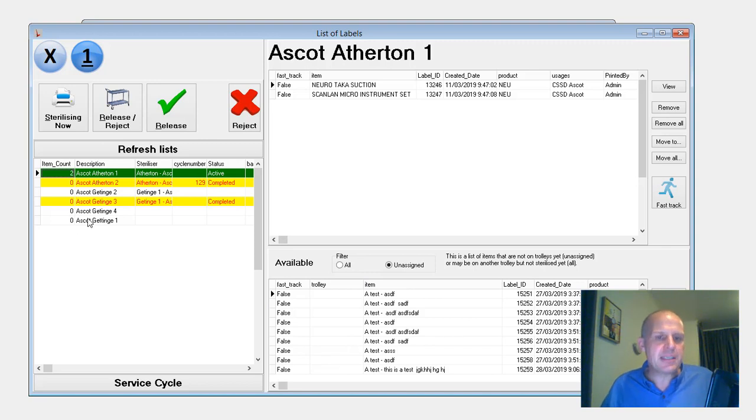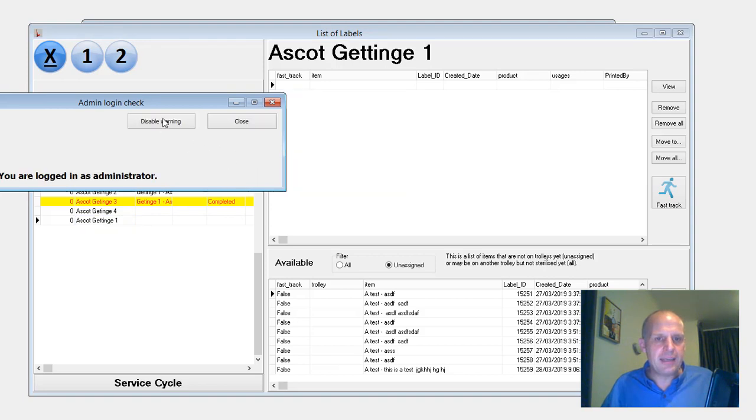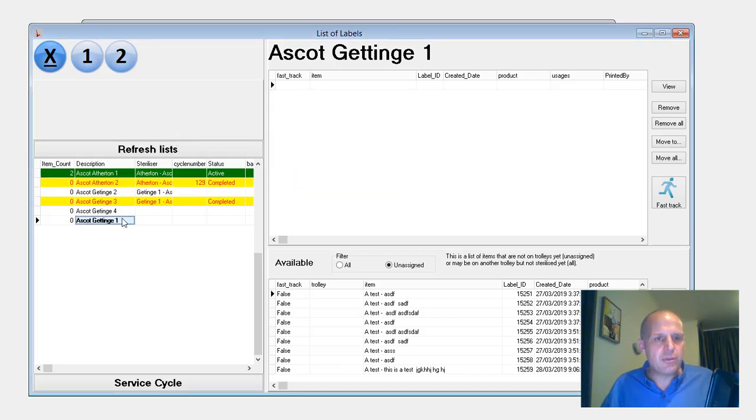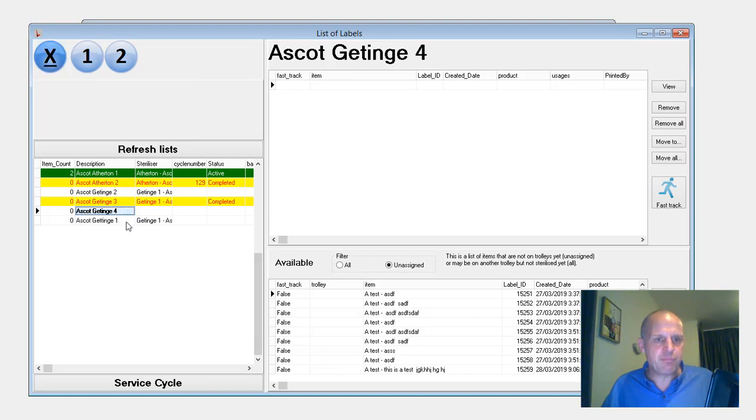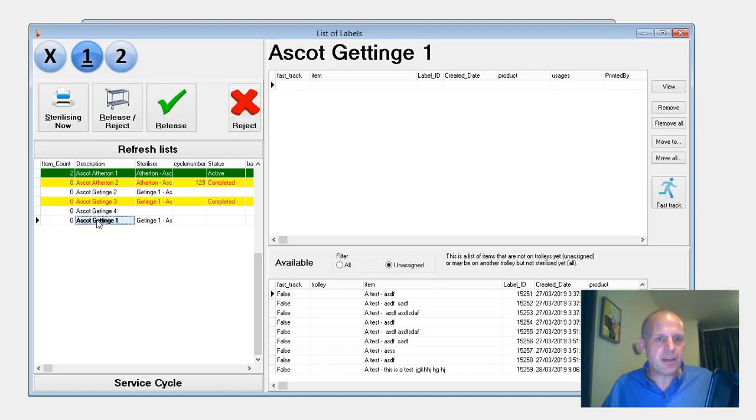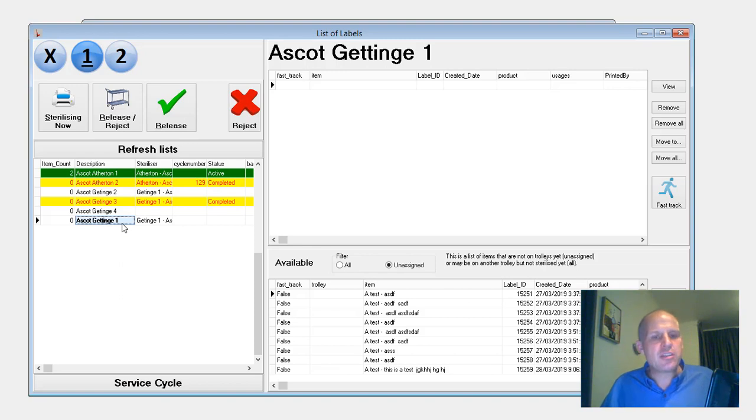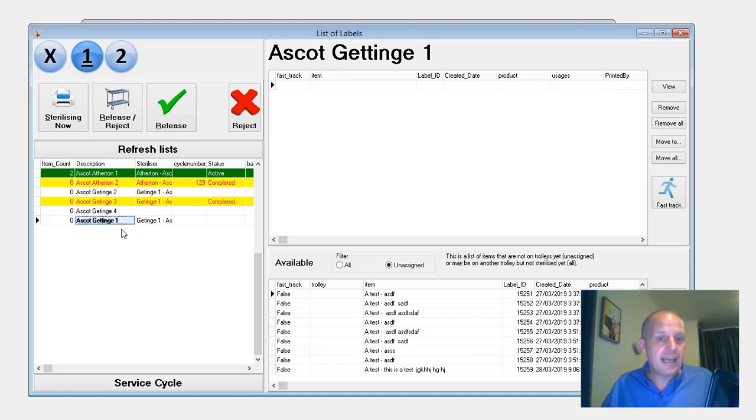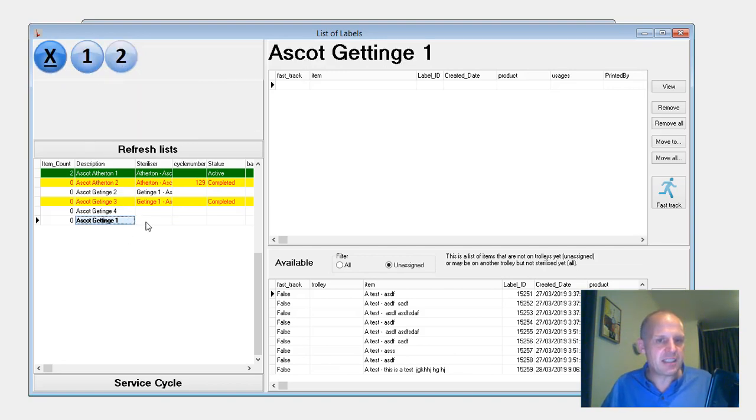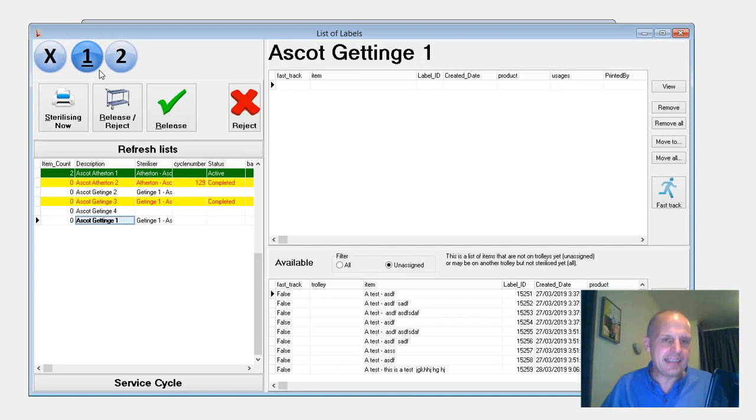But now what happens is, if I'm loading this trolley into Sterilizer 1, for example, I've pushed the one and now it's now locked into saying it's now been placed in that steriliser. And I can press sterilising now and I won't be able to scan any more items onto that trolley. So that's just making it easier for it to be hopefully more obvious to what's going on. But for whatever reason, if we decide not to turn that steriliser on and we want to remove that trolley again, we just press the X and that's going to clear. That's cleared there. We can now scan more items back onto it, pop it back in the steriliser, press one, and it shows that it's in there.